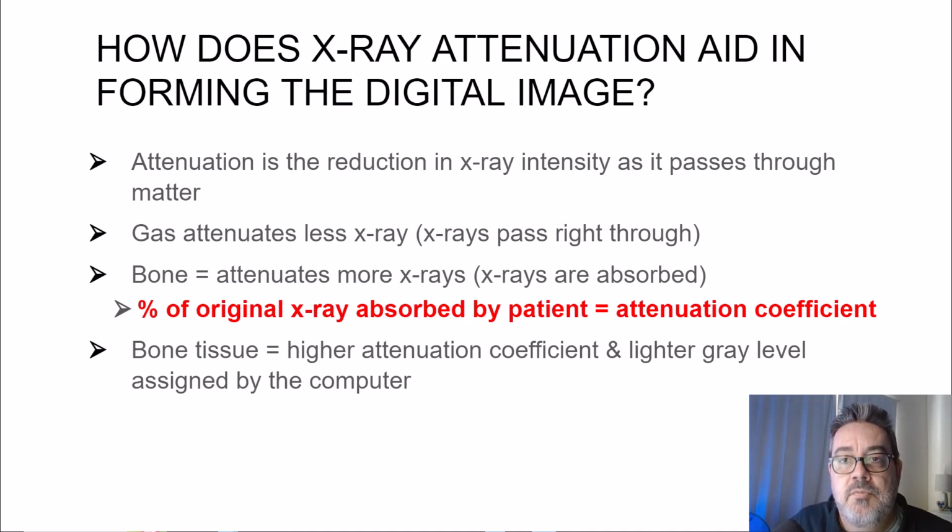Provide it with optimum exposure. You'll see the digital equipment provides some amazing work as long as you give it a good signal, but you must take into consideration the variation each patient brings in order to manipulate your technical factors to send the system a great sample. I'm off my soapbox now. Please make sure you understand how subject contrast and image contrast are related, though.